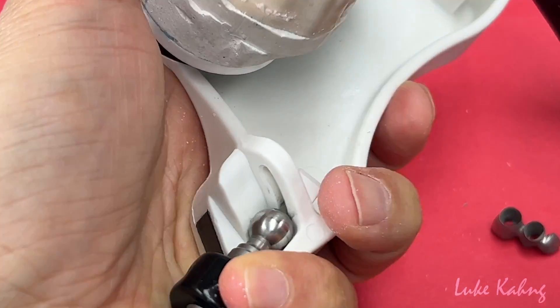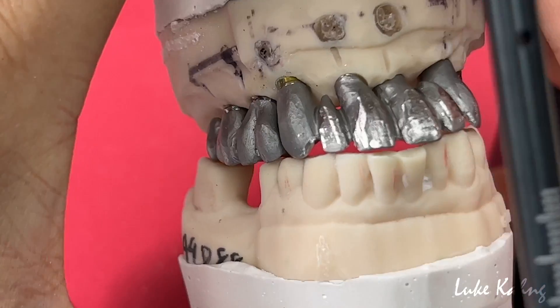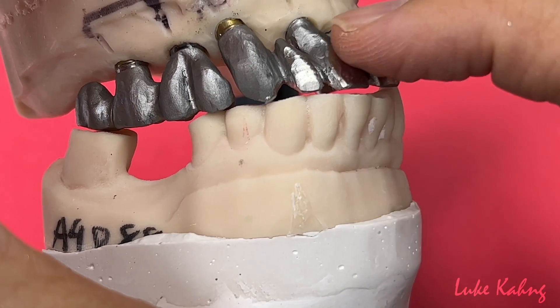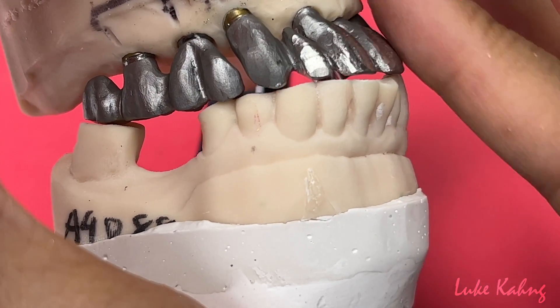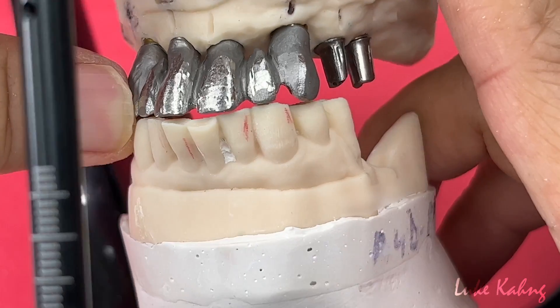We got the bite, then I got a good emergence profile. So we grind a little bit over here to get better contours, and not only that — I can get a better color.